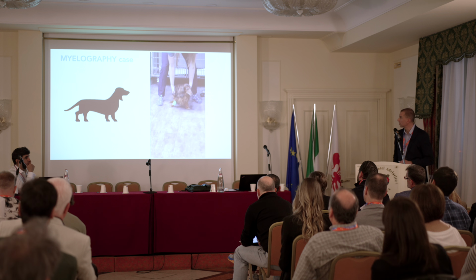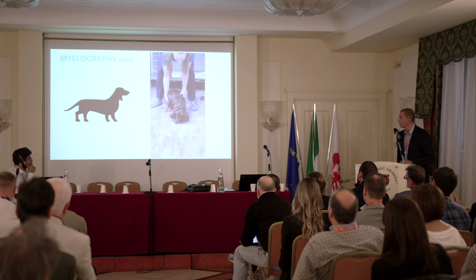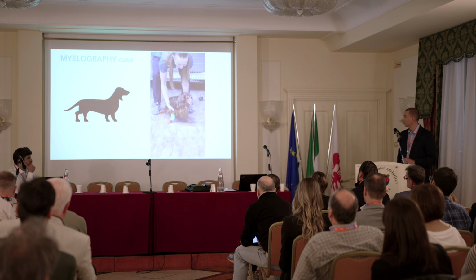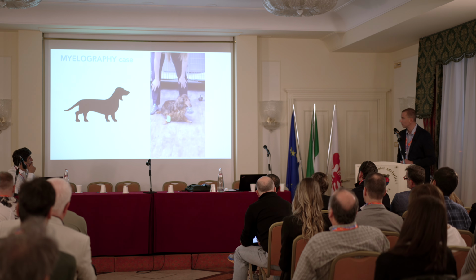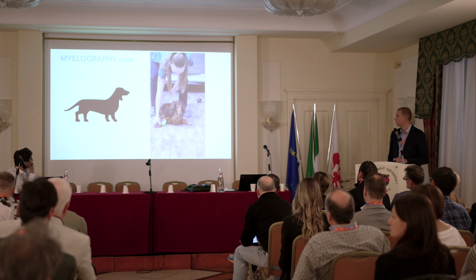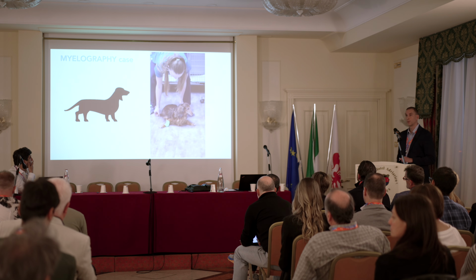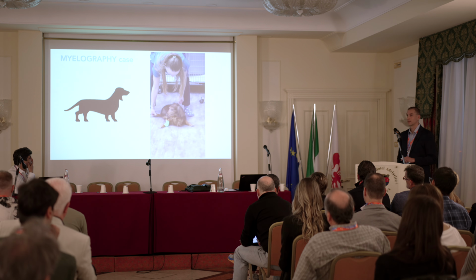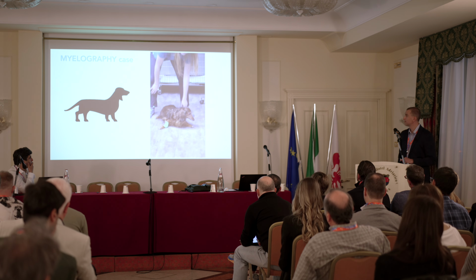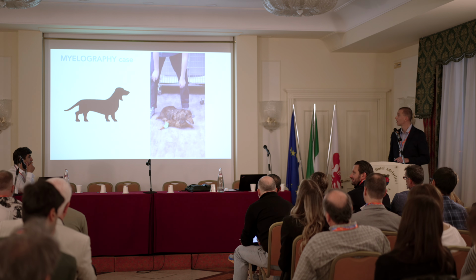You can see nice Czech girl, and there were less spinal reflexes on the 4 legs. So what you will do with this case? Some idea?